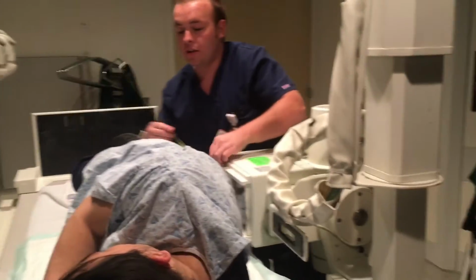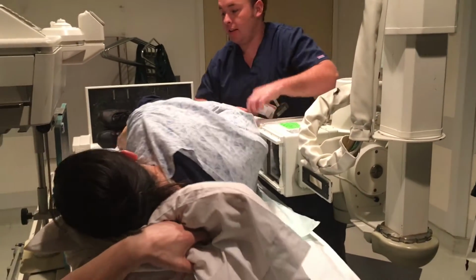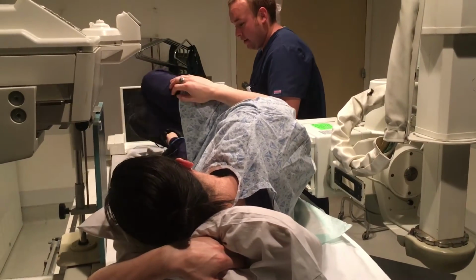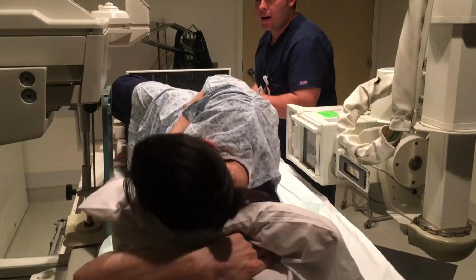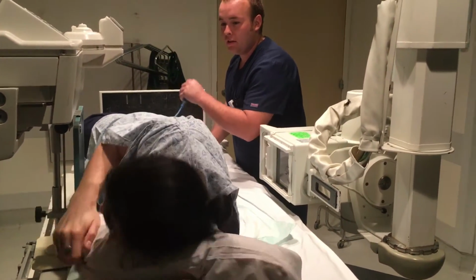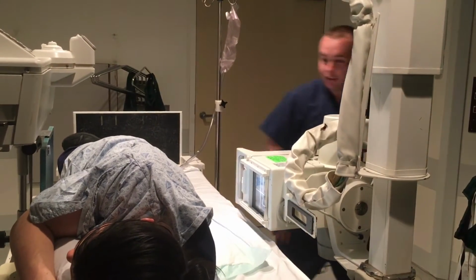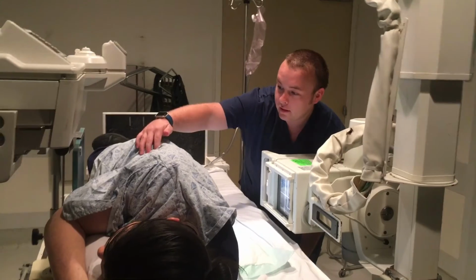Exactly. Alright, so go ahead and try to move all the way up to the board if you can. Belly against it. Watch this little hose there. You're good. I got you. I'm going to apply a little bit more air. I think some leaked out. Okay. Iliac crest.